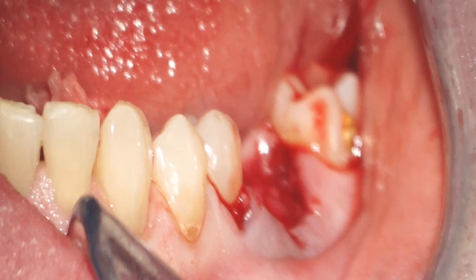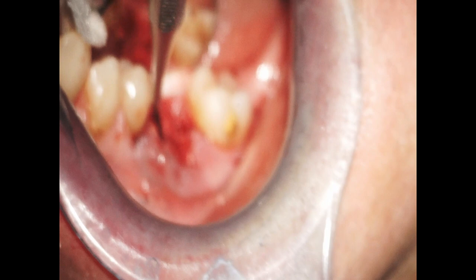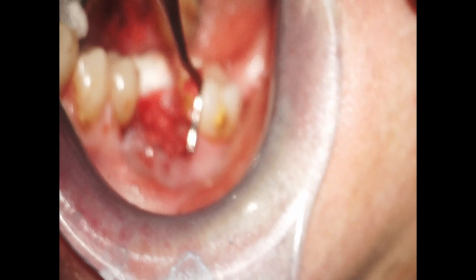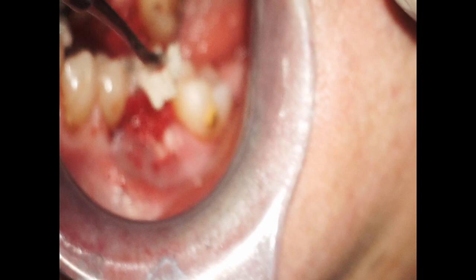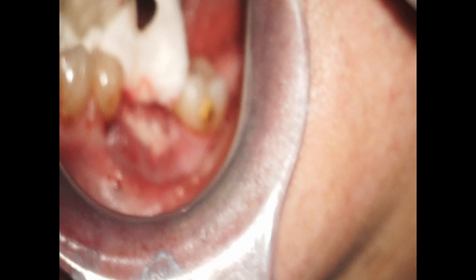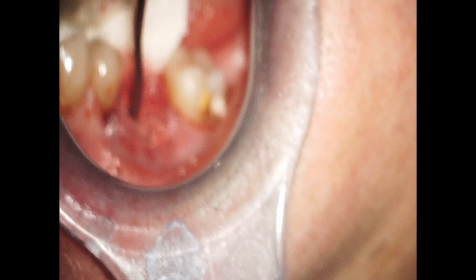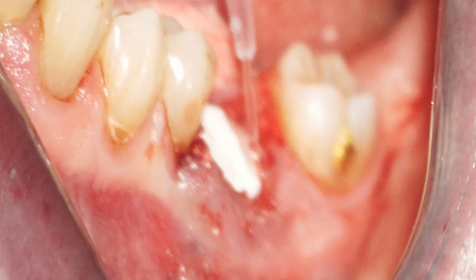My goal will be to regenerate the periodontium at the adjacent teeth as well as throughout the extraction site. Once completely debrided, I'll approach a sequence of packing and condensing the growth factor enhanced bone matrix that's already been soaking while I performed the extraction. I typically mix the graft material prior to beginning the extraction procedure so that it has at least 10 minutes. Here we're beginning to condense the bone — you can see the soft tissue moving on the buccal surface where there's complete loss of the buccal plate. I'll use sterile gauze and a bone condenser as well as the back end of a periosteal elevator.